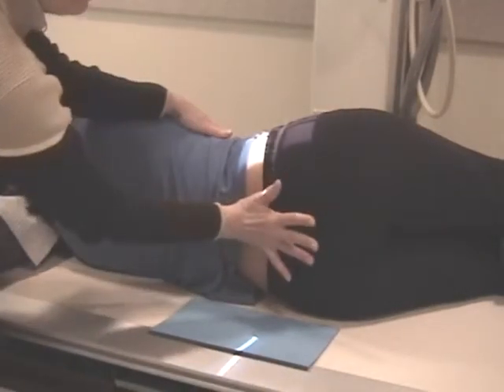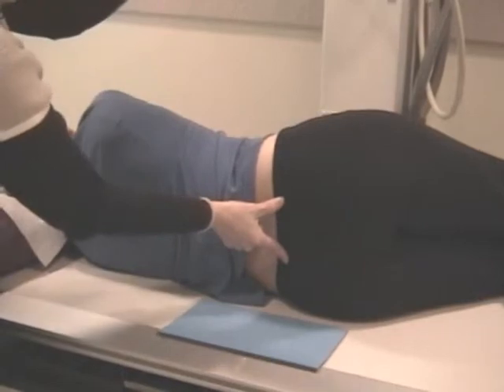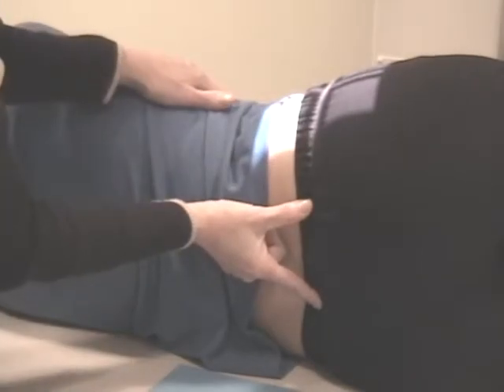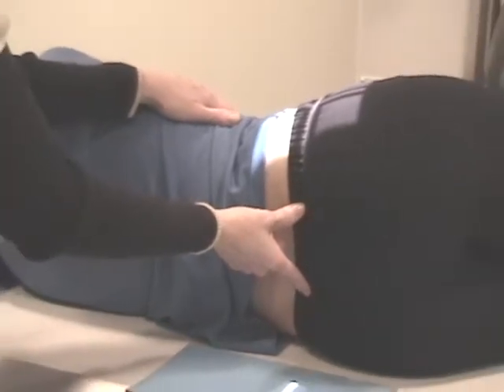Again, I wouldn't use my hand feeling this way. That could be too personal. Okay? Here I found the dimples, and if this crosshair, this one here, is coming right down through the dimples, I would be able to pretty much guarantee that you will have L5-S1 to the center of the film. Okay?